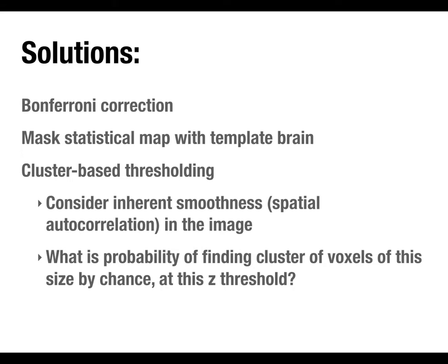But they've adjusted things, so now the software packages are a little more conservative and a little more principled about how they do it. But as you read through papers, even still sometimes you see stuff that gets published, and it is like some arbitrary number of voxels that they chose as a cluster threshold, or the p-value just doesn't make sense, or something like that.